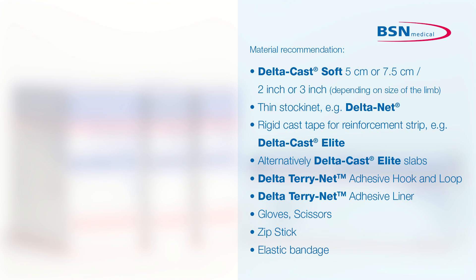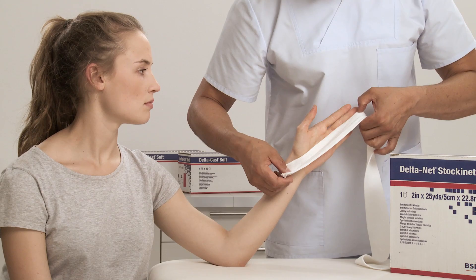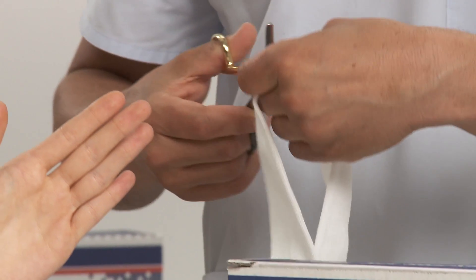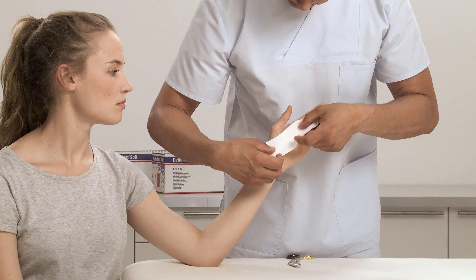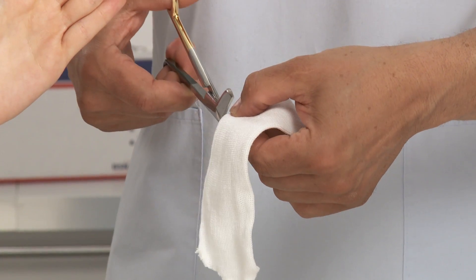Due to the semi-rigid properties of the Deltacast Soft, only minimal padding with a thin stockinette is required, allowing a snug fit. Choose the appropriate width of Deltanet stockinette that doesn't constrict the patient's hand and wrist. Measure the length from wrist to the distal end of the fingers and cut to the desired length.